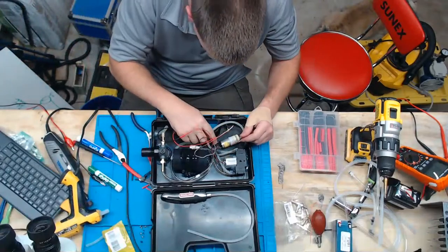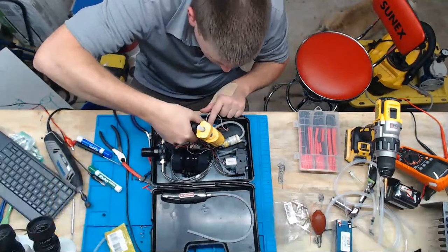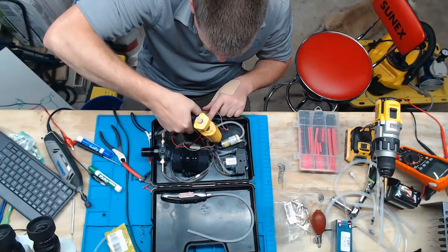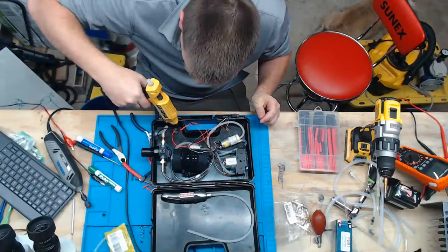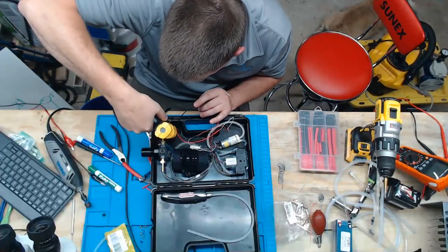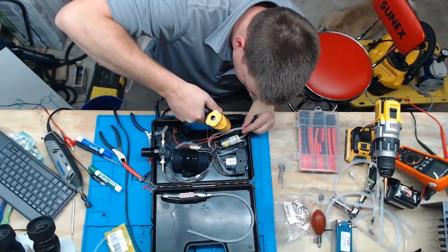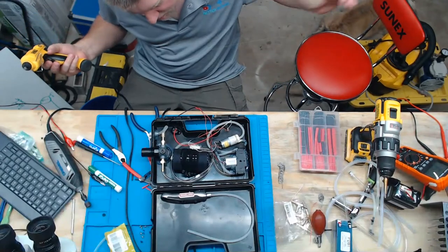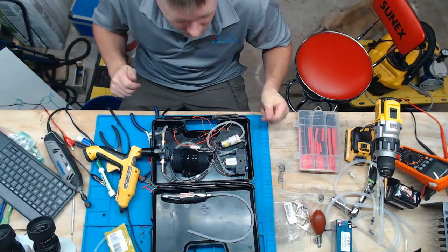Okay, so that should be all the soldering needed. I should have put something down on my leads down here. Tell you what, so we got some of this for... I don't want these wires bouncing around down inside this case, snapping off at the motor housing. All right, that's going to be very good. I use hot glue, not necessarily as an adhesive, but more like a Silastic, which is a material that you squirt down to keep things from vibrating around. Basically makes everything more permanent, more durable.